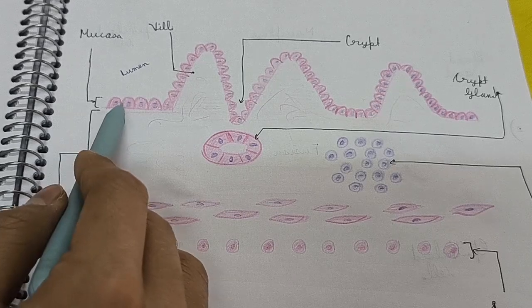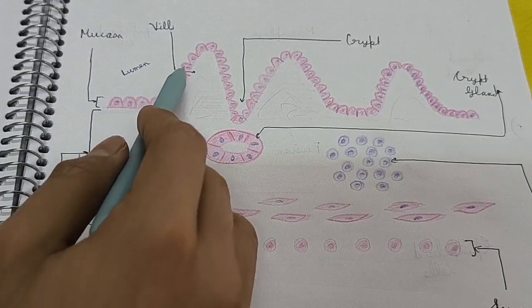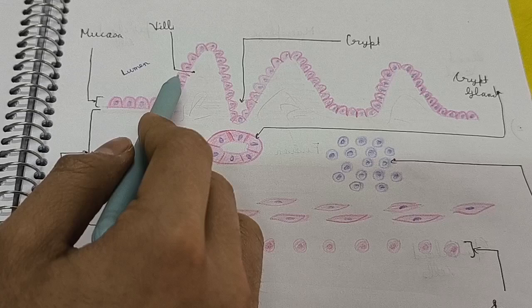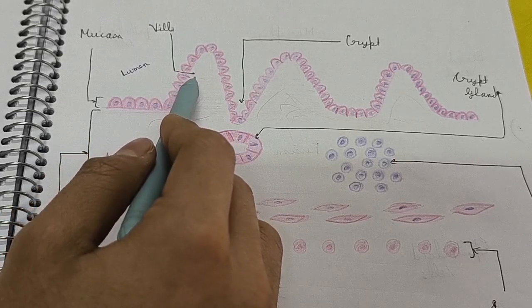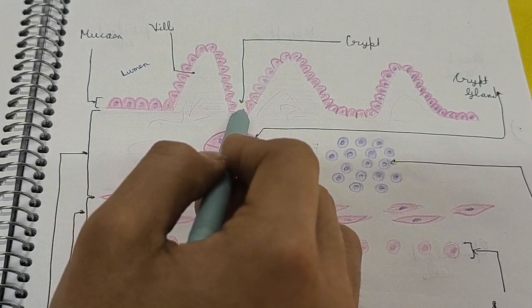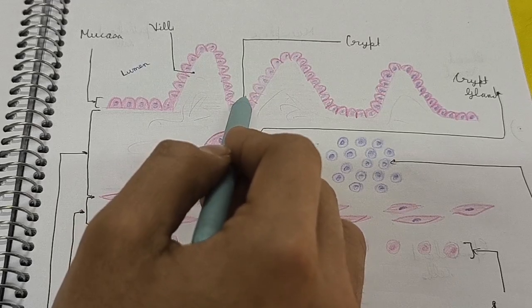You can notice that the mucosa of intestine extends into the lumen, and that elevation of the mucosa into the lumen of the intestine leads to the formation of villi, and a depression of that mucosa, again to reach the normal line, is known as the crypt.